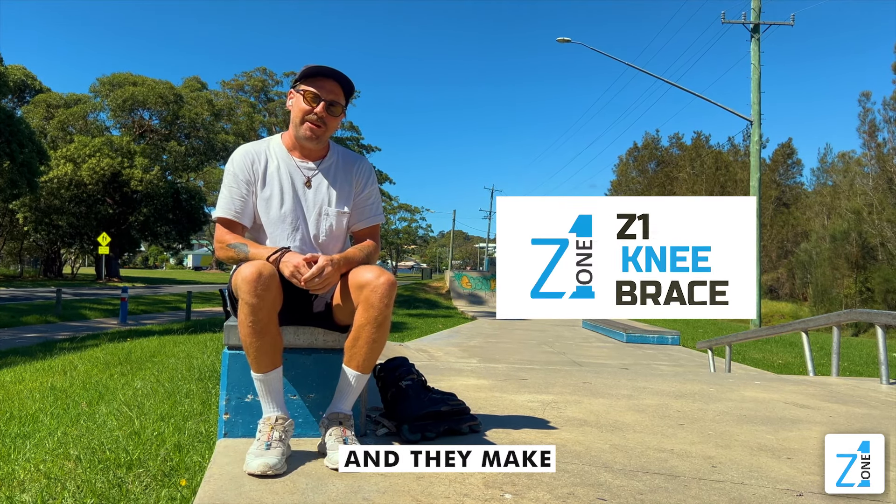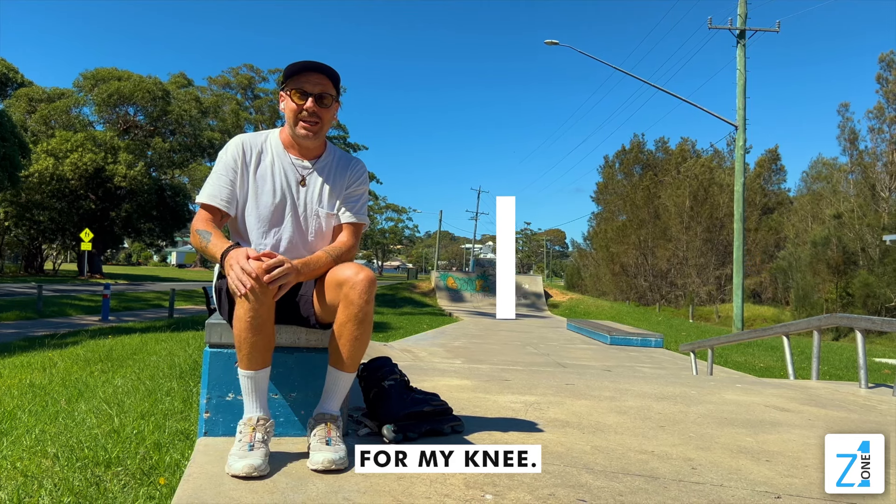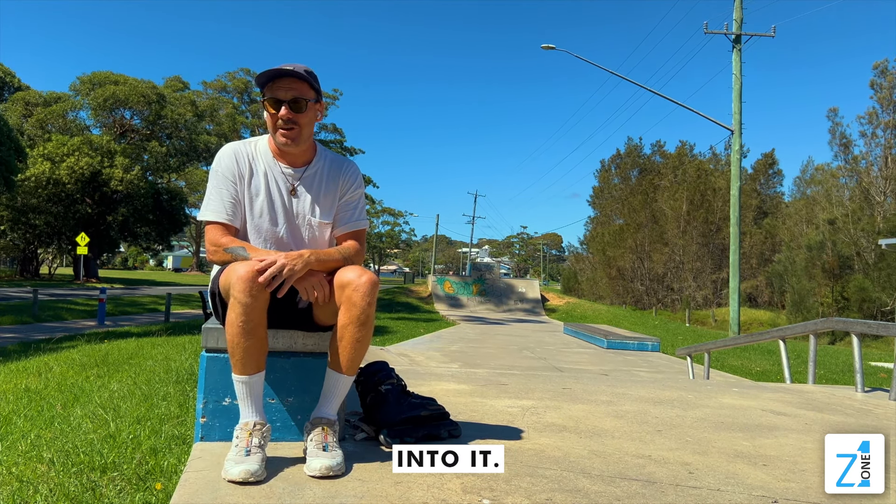I've just talked with Z1 and they make a custom knee brace, so I'm going to get one of these for my knee. But to do that I have to take measurements of my knee. So let's jump straight into it.